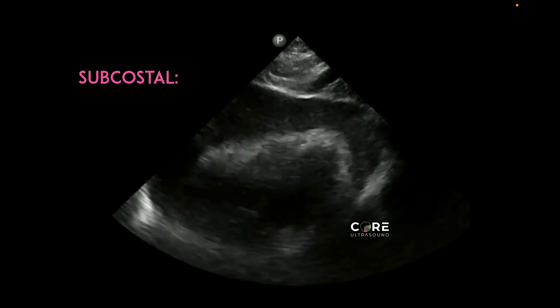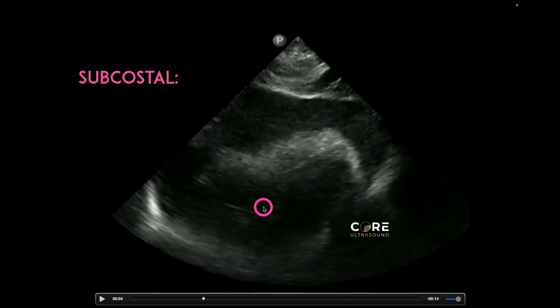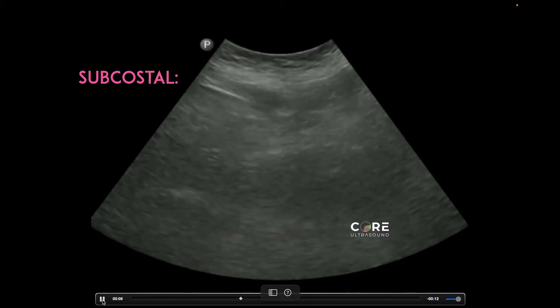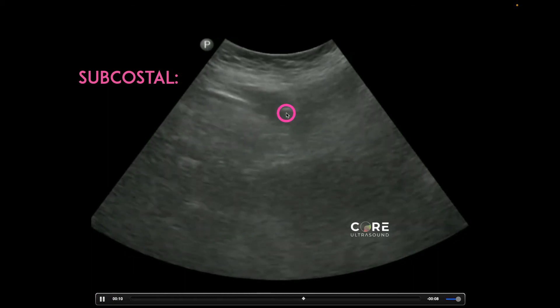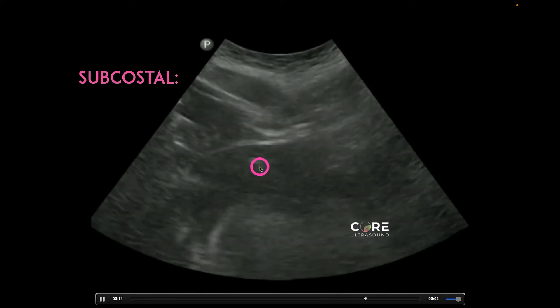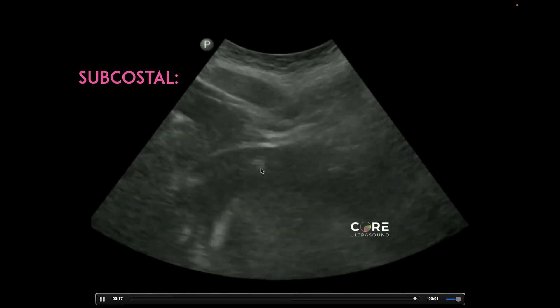Here we see a subcostal window with the heart, and this is just the identification of that effusion-causing tamponade. This practitioner — courtesy of Sono ClipShare — decreased the depth and changed to a curvilinear transducer to see a little bit better. You can see right here the needle coming into the right area, and then the needle popping right into that pericardial sac to drain this effusion.